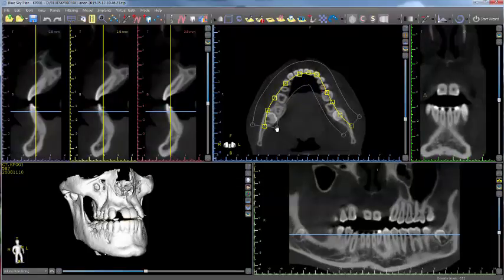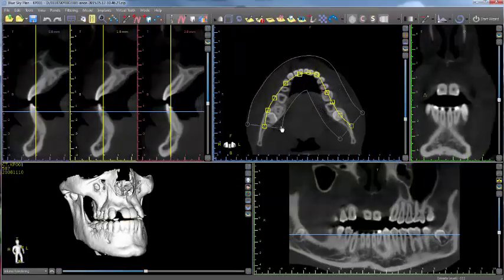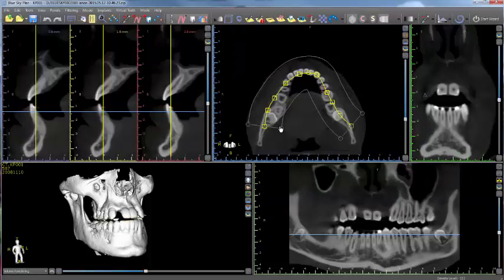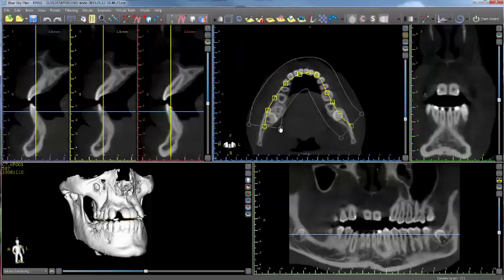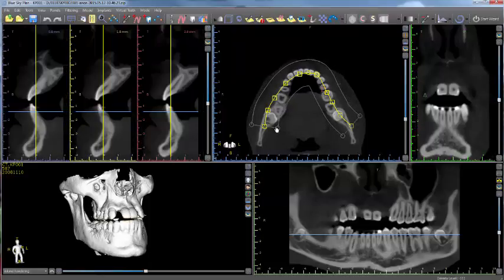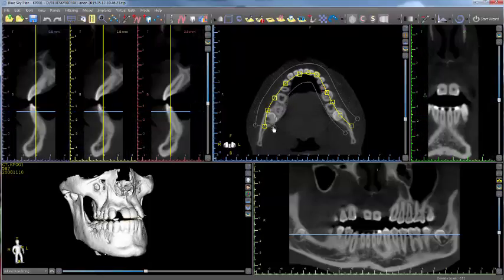The width of the composite view can be controlled by adjusting the inner and outer composite curves. Dragging any of the four round control points at the end of the curve will include or exclude more slices. In addition, it will control the field of view in both the cross sections and the tangential views.